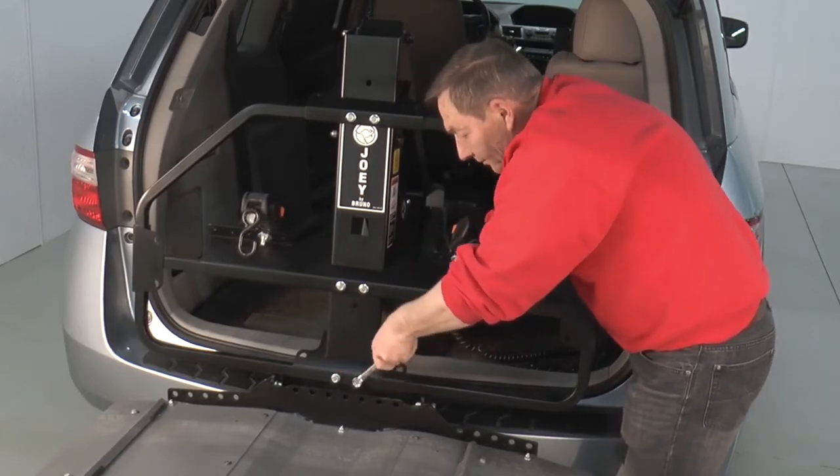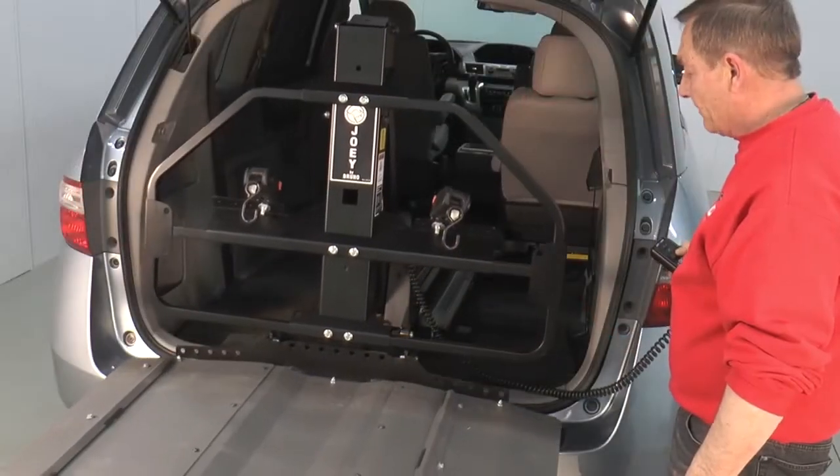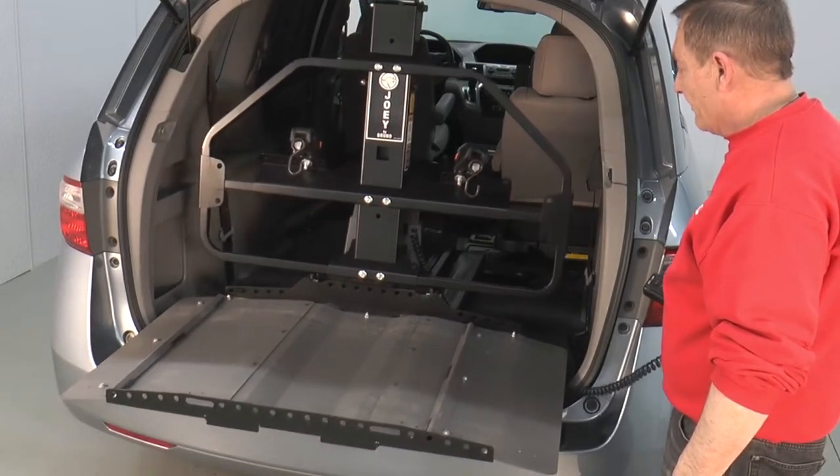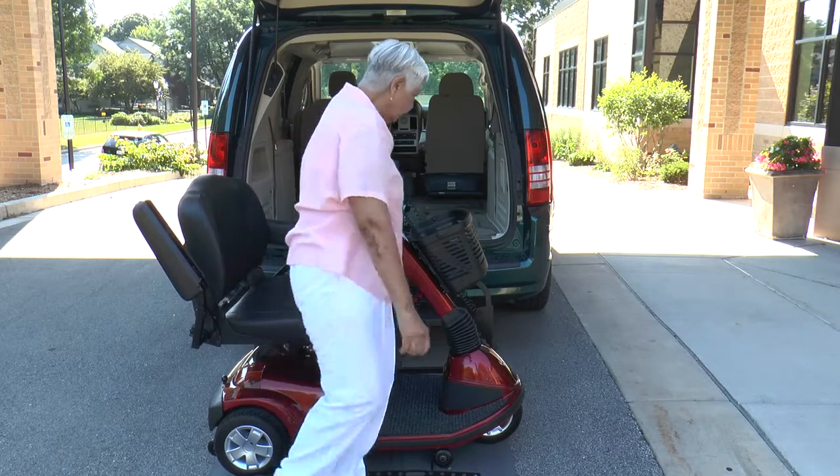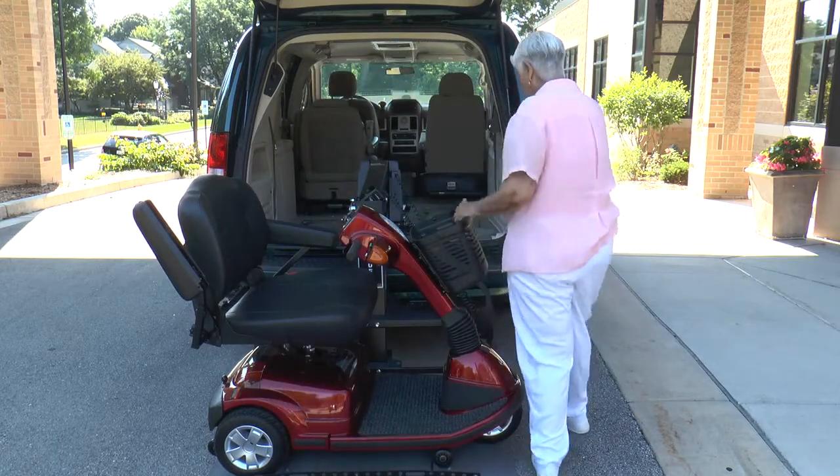Your local Bruno authorized dealer can quickly install the Joey, and if you purchase a new minivan or van in the future, it's likely the Joey can be reinstalled. There's no need to make any modifications to the scooter or power chair when using a Joey.